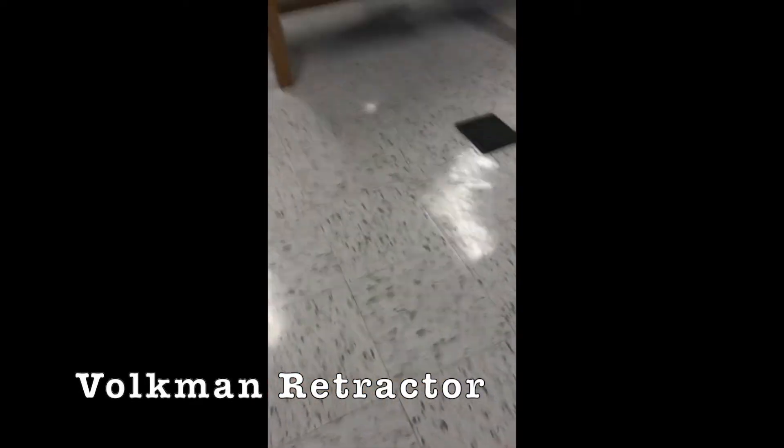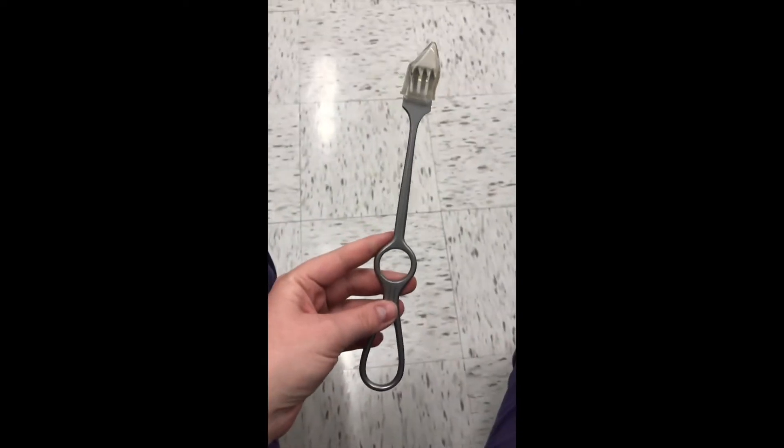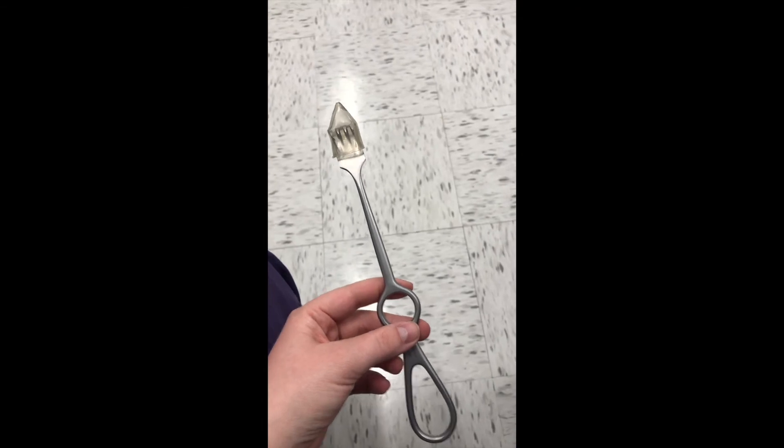And then the Volkmann, and then the one with the two little wings is called the Meyer-Murphy.